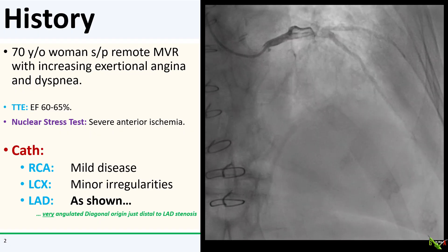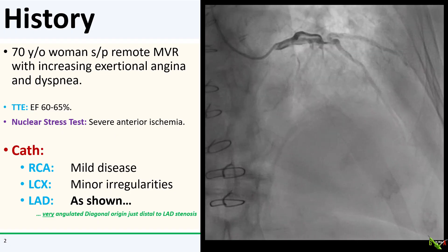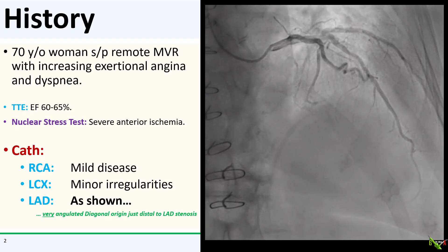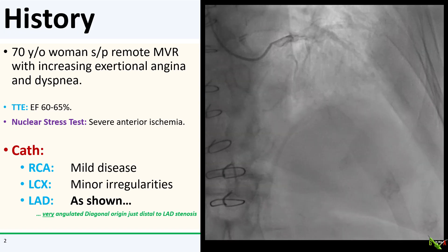However, there is also a large diagonal branch which arises just after the LAD lesion. The diagonal has a very angulated, almost reverse takeoff from the LAD, and there seems to be a lesion at the ostium of that diagonal. This one is going to be a hard one to wire.